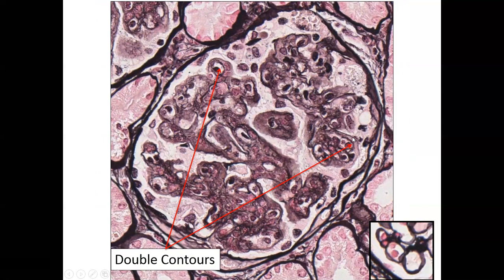So this is what the podocyte had already been making, or what was already pre-existing, and this is new GBM that the endothelial cells started to lay down. And so they're trying to wall themselves off from whatever this material is in here, and most of the time it's the immune complexes.